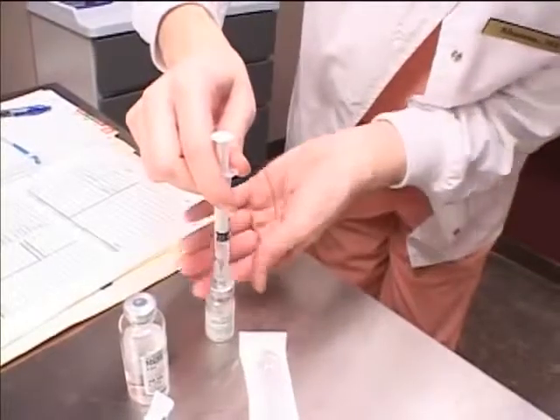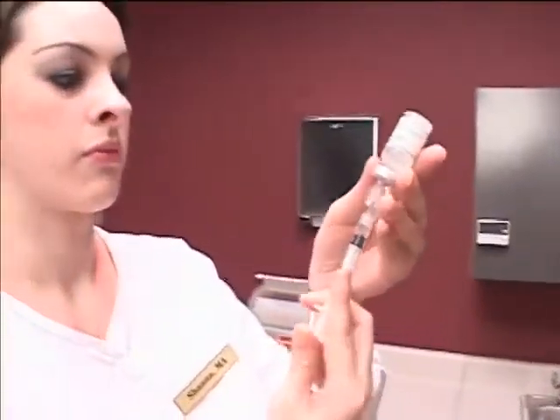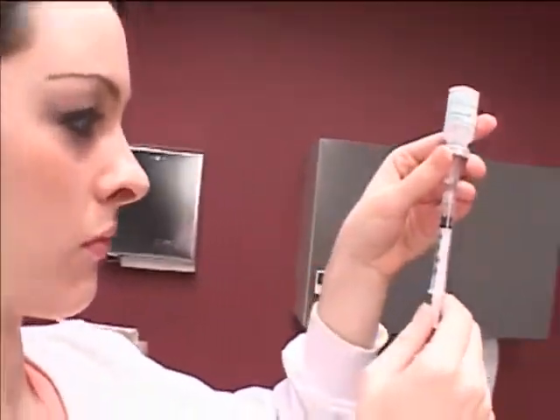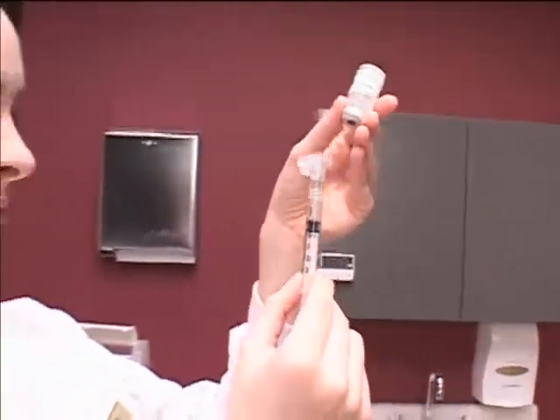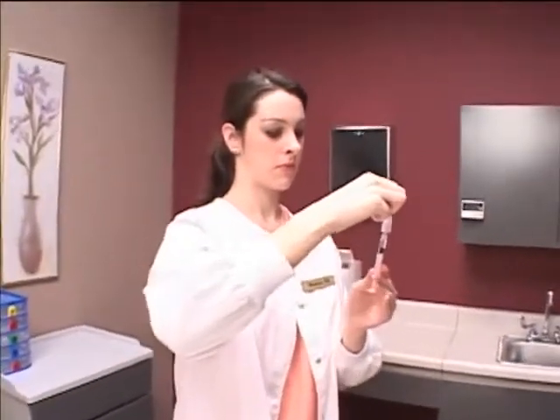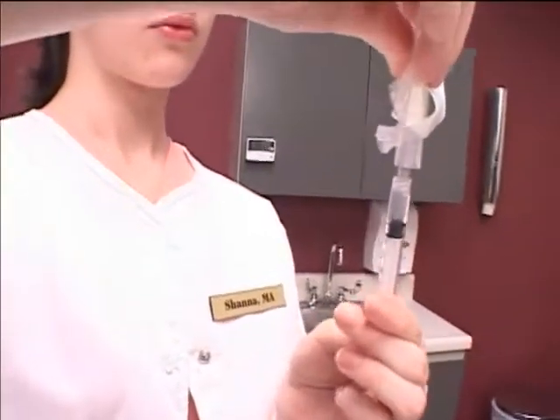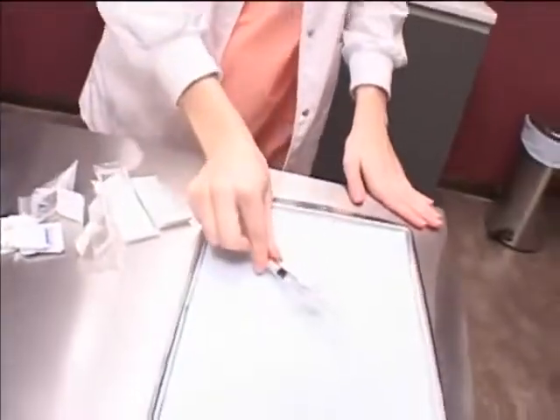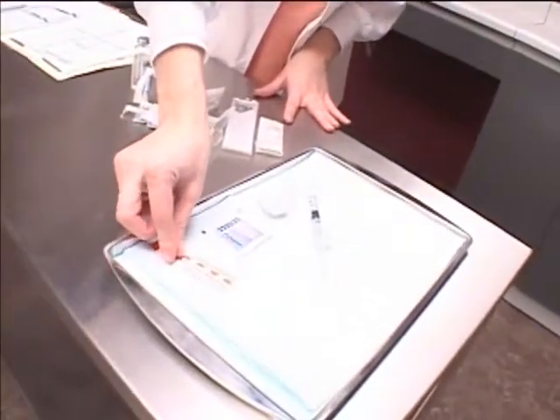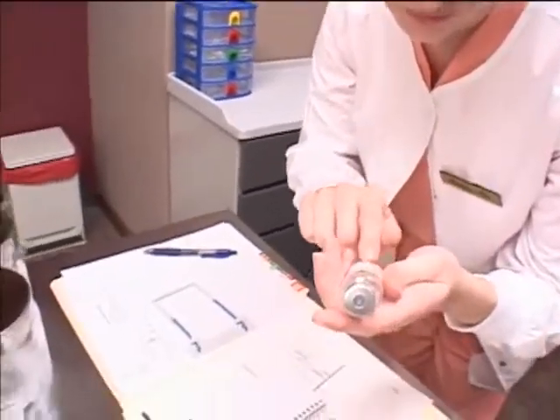Insert the new needle into the second vial. Invert the vial and gently withdraw the medication from the second vial to the volume in milliliters equal to the total of both medications added together. Remove the syringe from the vial and follow the institutional policy regarding the recapping of needles. Remove any air bubbles by gently flicking the syringe and change the needle if appropriate. Place the syringe, cotton balls, alcohol pad, and adhesive bandage onto a medication tray. Recheck that you have the correct medication one more time prior to returning the vials.